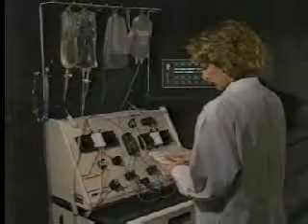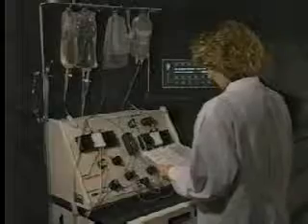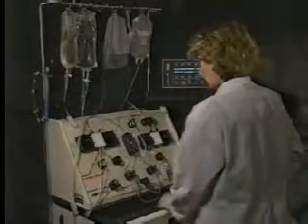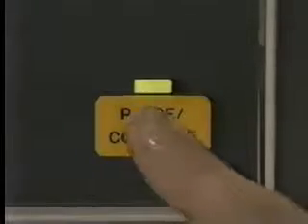Let's review 2 of the possible causes for the centrifuge pressure high alarm. First, this alarm would occur if there were twisted or pinched lines in the centrifuge. Open the centrifuge chamber, examine all the lines, reseat any loose lines, and close the centrifuge chamber. Press continue to clear the alarm.